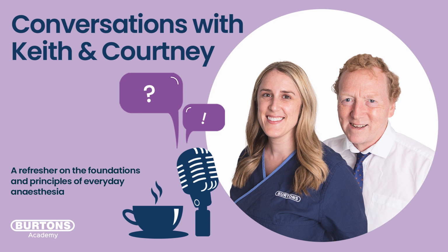So basically, if your ventilator doesn't have an assist mode, then just decrease the respiratory rate. So you were ventilating at 20 breaths per minute, now drop it to 15. You were ventilating at 200 mils, drop it to 180. Your target pressure when your volume cycling was, say, 13, drop it to 11 or 10. So you're giving smaller, lesser breaths, basically.